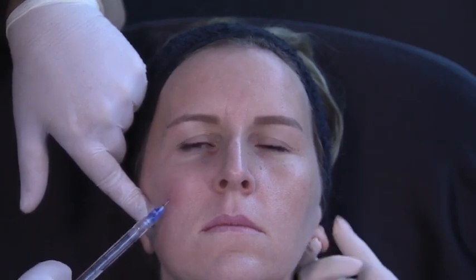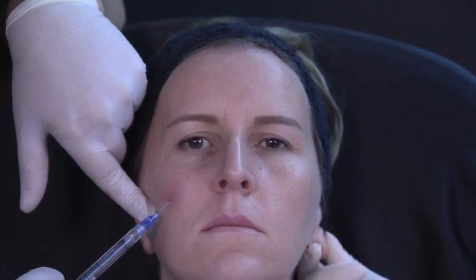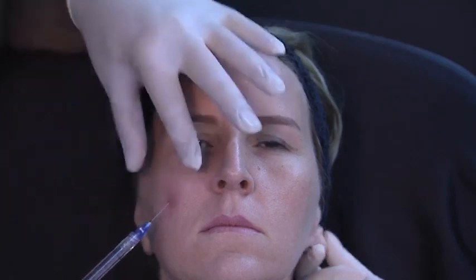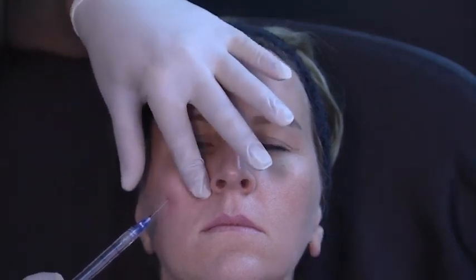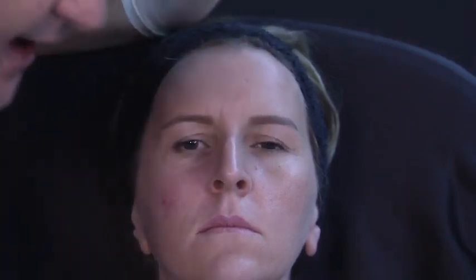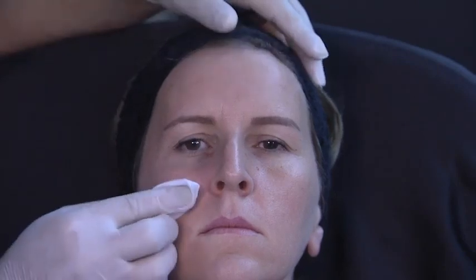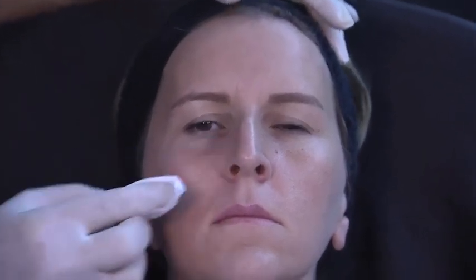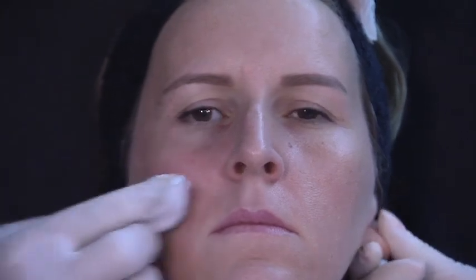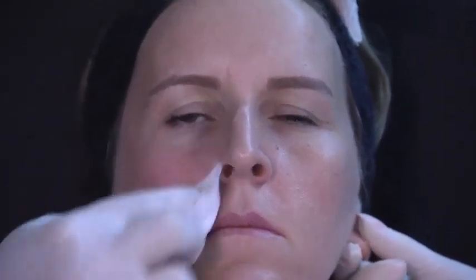Okay? Right. We do have to mention that in the area where you're injecting, we have to be cautious and conscious about the infraorbital foramen. The infraorbital nerve exit is more medial, as I drew with my pen. Exactly, it's a little bit more medial, and I always have my finger protecting. So when we finish, we mold upwards towards the tear trough. Now this product has a level of cross-linking of 3, but the particle size is the biggest.